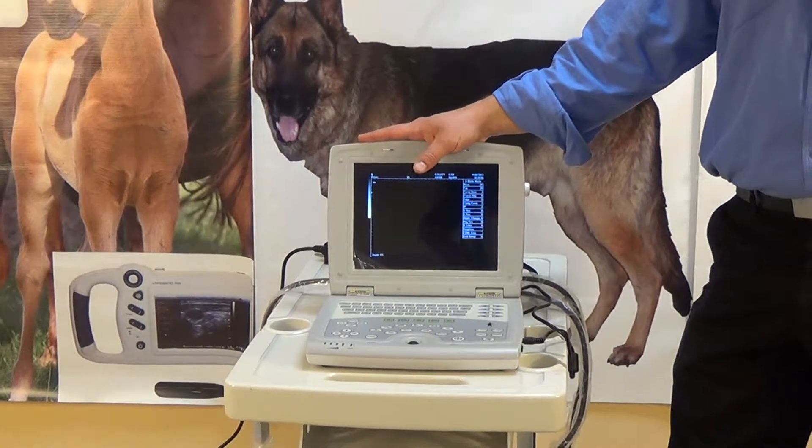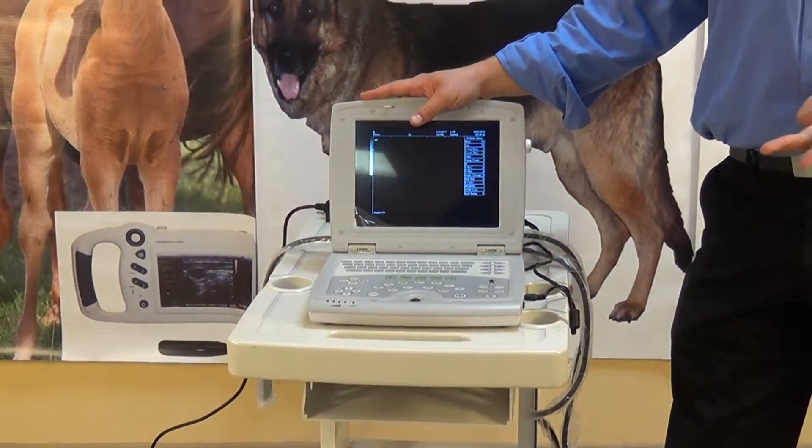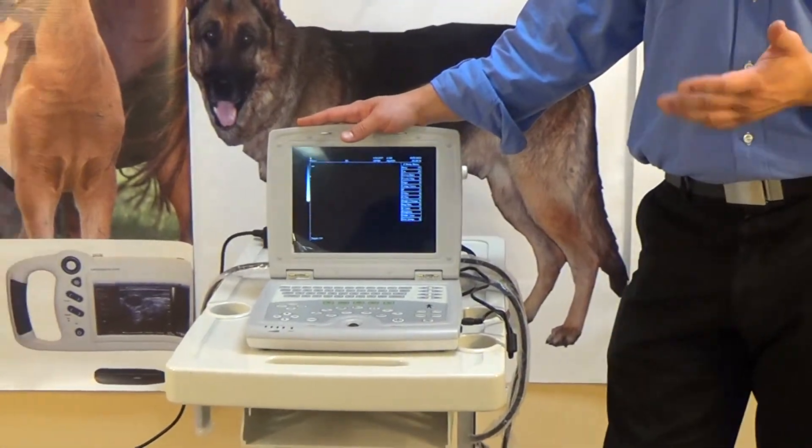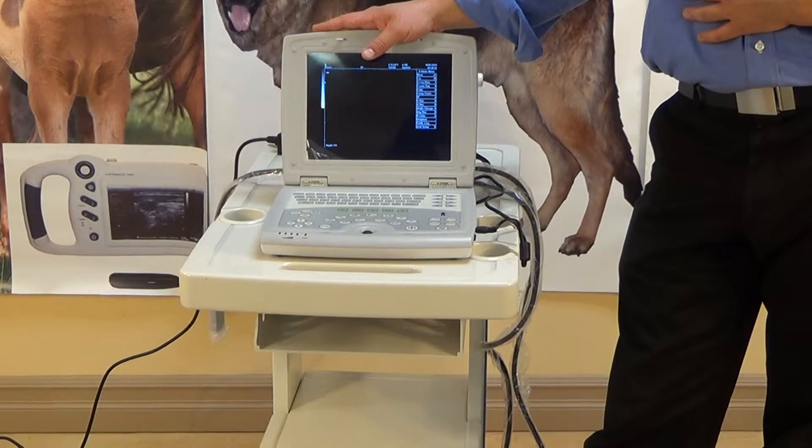This is probably primarily purchased by everybody. We get farmers, we get ranchers, we get veterinarians as well who use it. It's a really good, portable, small ultrasound machine that really covers a lot of the needs and necessities for most people.